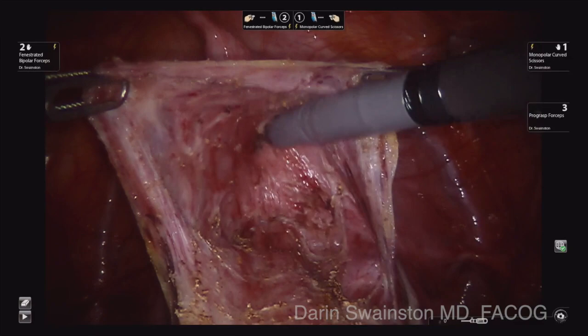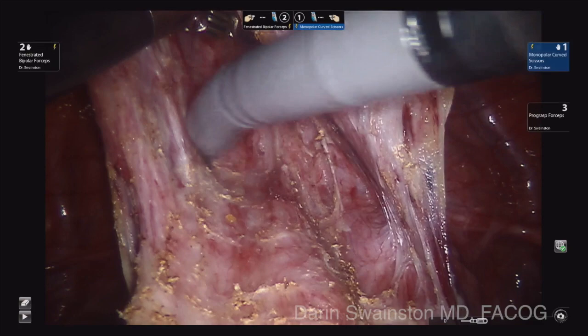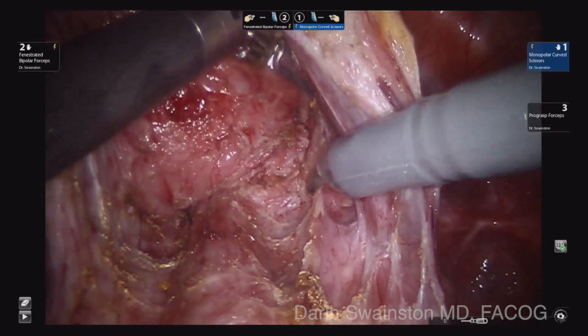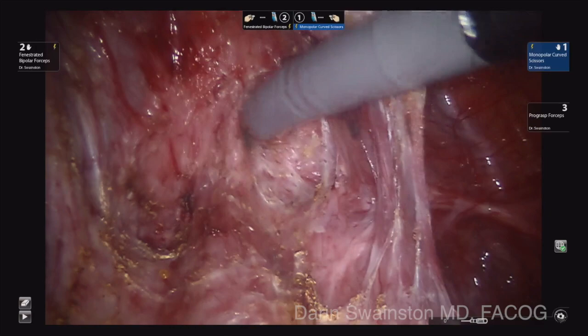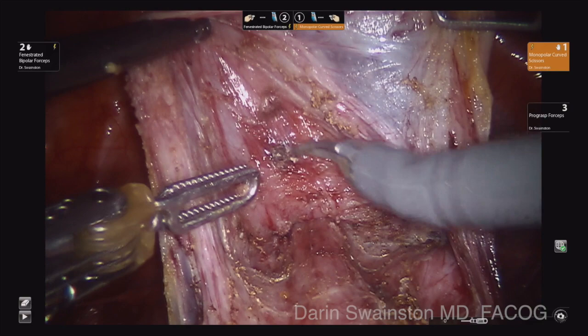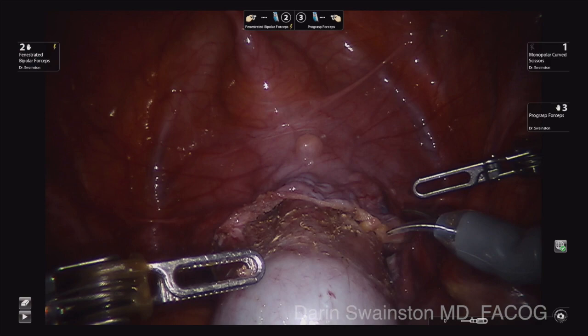Try to go as wide as you think is necessary but do not damage any existing connective tissue. That left side has some healthy connective tissue so I am trying to preserve that, but I am going to take a little of this down here and dissect that off, just making sure I get the width I need so that this mesh can lay in there flat and I do not have to trim it too much. There is that push-spread-and-pull technique. The assistant has come in with the suction, which can also just help provide support and pull up on that.